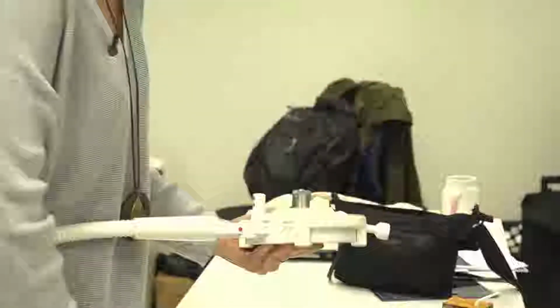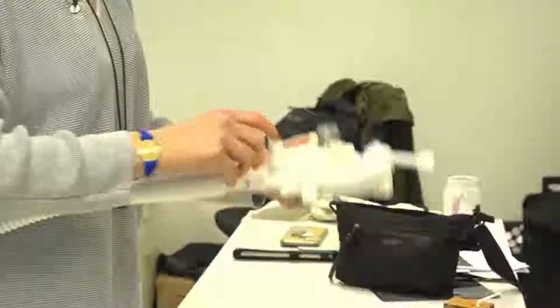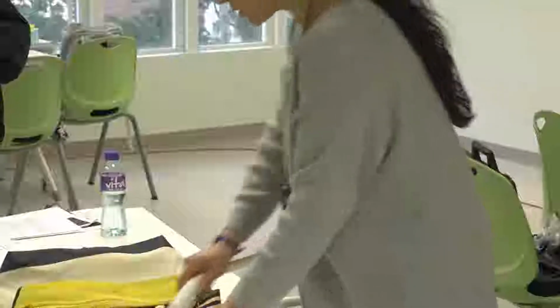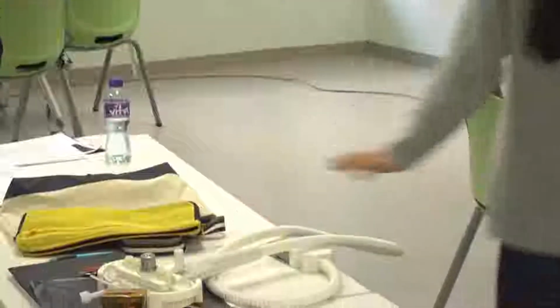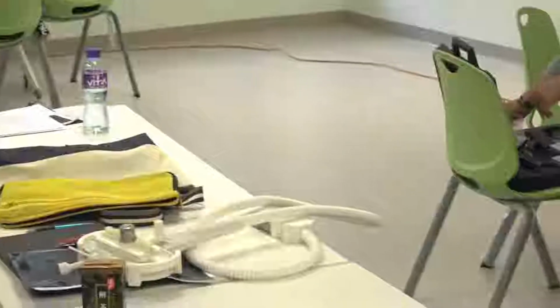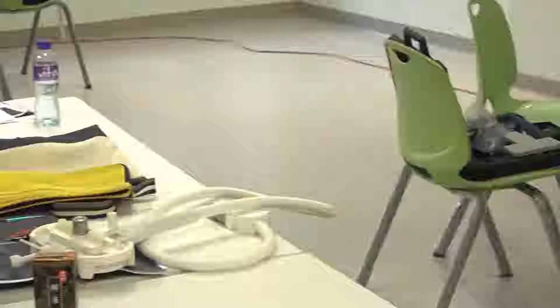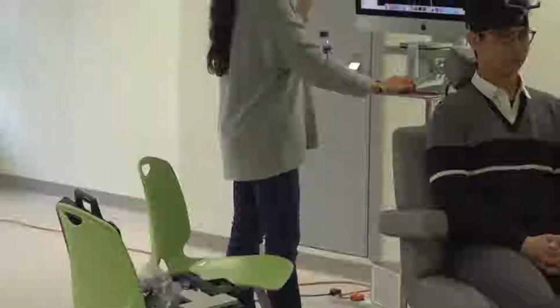So you tighten it, and I will use, I think, this one to locate my sensor. I need to put my sensor here. And I'm going to use the CT670.